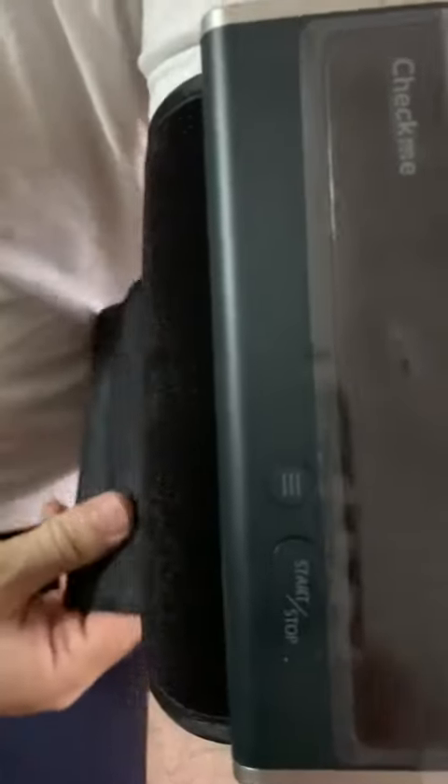This is the Check Me blood pressure monitor. It's very slim. You slide it into your left arm and just make sure that the buttons are towards you, to the right side of the arm.